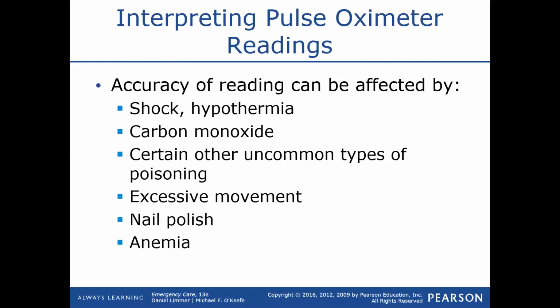But those SpCO meters, if we put them on somebody who came out of a smoky fire and it's reading 25, that's serious. And really the only way to clean out your system before you die is to go to a hyperbaric chamber. And the closest one is in Pittsburgh, I believe. So they'd have to fly you to Pittsburgh and put you in this oxygen room, basically. It might actually be a tube. I've never seen one before, but they just pump you full of oxygen all day long, and you could be there for days just in this environment to get the carbon monoxide out.